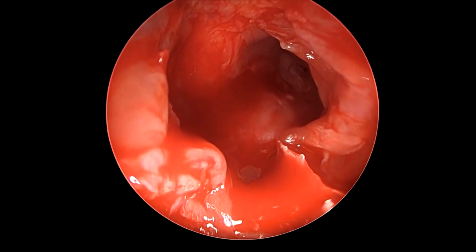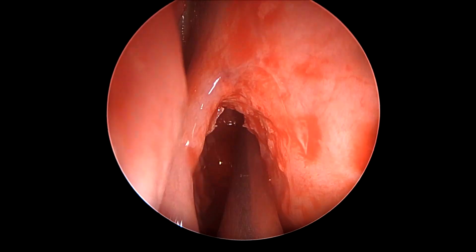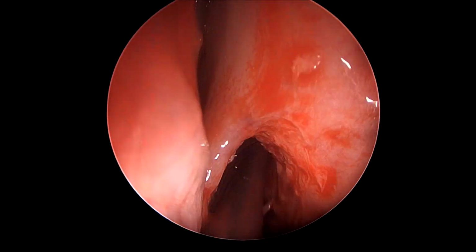So you can see how the entire frontal bulla cell has now been cleared, and our access inside the frontal sinus in this revision situation is complete.